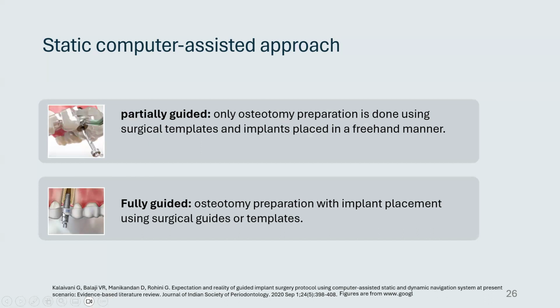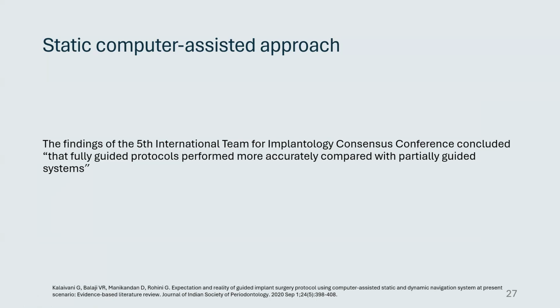For the fully guided, the surgical guide is used to prepare the implant site and to place the implant. So implant placement is done using the surgical guides. Okay, according to the ITI consensus, the fully guided protocol performed more accurately compared with the partially guided systems.